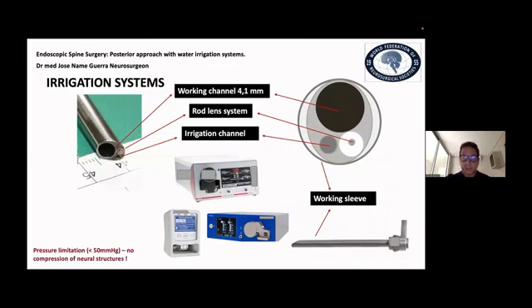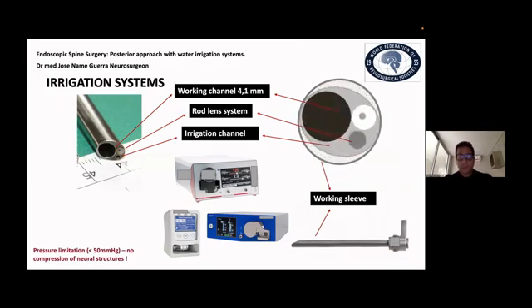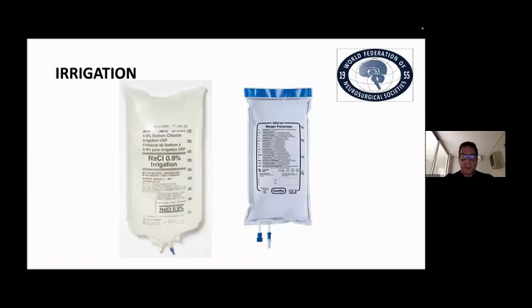Both systems use irrigation during the entire surgery. You can use a pump, or you can let the fluid fall by gravity through the bags. The working channel of the scopes is normally 4 millimeters, and when we use a pump, we should use a pressure below the diastolic pressure of the patient in order to avoid excessive pressure on the neural structures. If you have bleeding, you can increase the pressure of irrigation and volume, but only for a short time. Regarding the irrigation, use normally saline or Ringer. I prefer to use Ringer because it's more similar to the CSF.